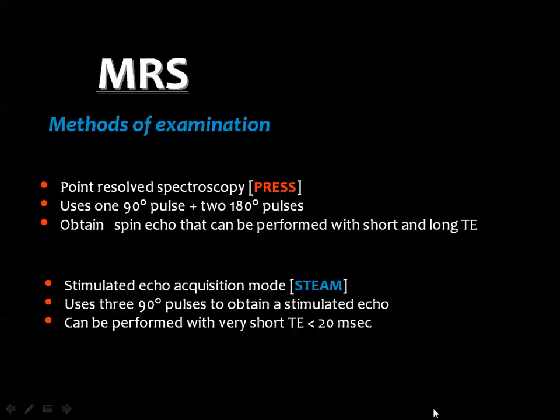Then we have two methods for obtaining an MR spectroscopy: number one, the PRESS technique, and the STEAM technique. PRESS is the abbreviation of point resolved spectroscopy, and STEAM is the abbreviation of stimulated echo acquisition mode. This technique may use a 90-degree pulse and two 180-degree pulses, while the STEAM technique, which is more popular and can be performed with very short TE times, uses three 90-degree pulses.